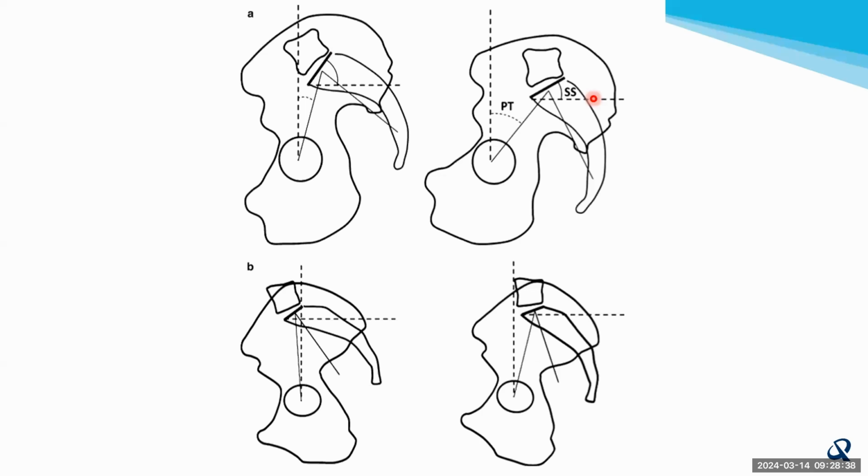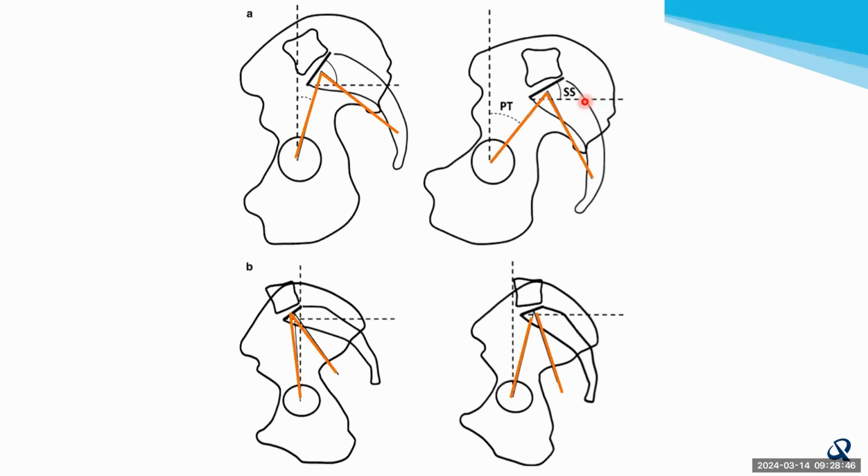Everyone should be following along so far, I hope. The second one is the angle that's a little bit less intuitive. And this angle, highlighted in red, is the pelvic incidence. The pelvic incidence for a person doesn't change, and that's because your pelvis is a pretty set structure. So the bony ring doesn't really move relative to other parts of the bony ring.